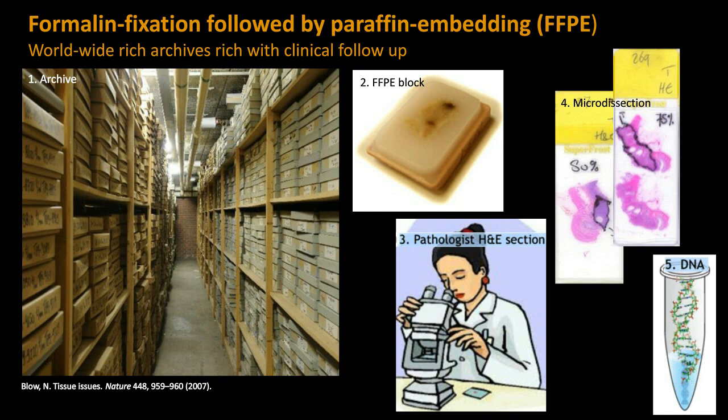So from the FFPE blocks, we take sections that are evaluated by a pathologist like Daphne, and thereby we can also delineate or demarcate and enrich for the malignant cells if necessary. And then in the laboratory, we can just use a scalpel and scrape the region that has the highest tumor cell percentage. For lymphoma, this enrichment step is often not necessary since the material is already very rich in malignant cells, and we often use just scrolls for this.